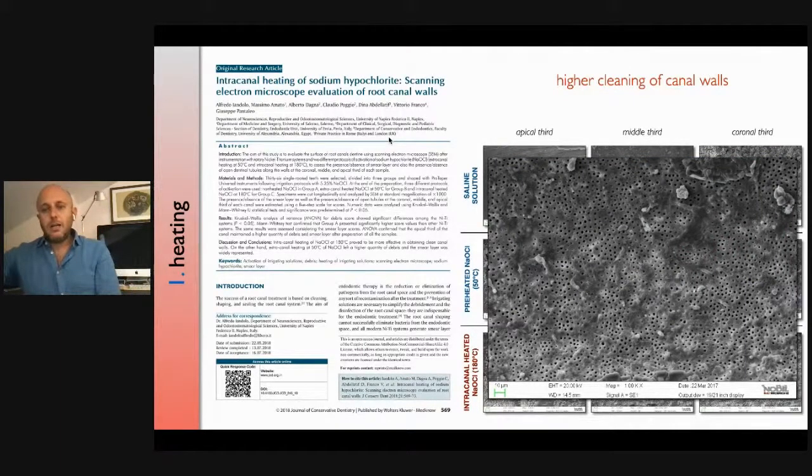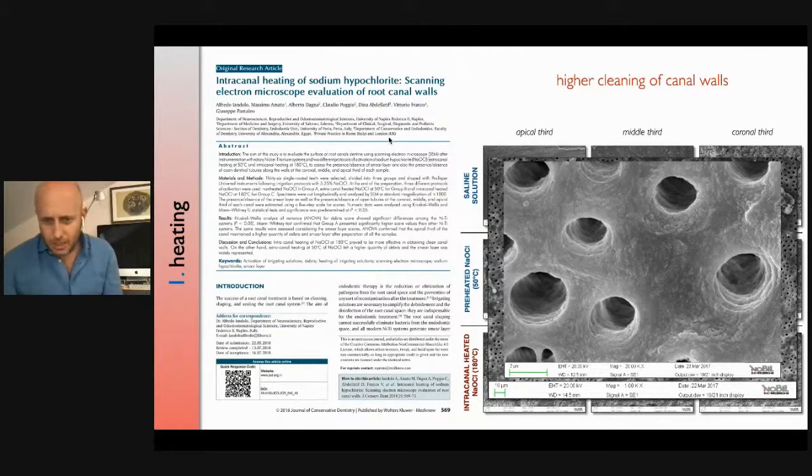These images we took at the University of Pavia are images of dentinal walls cleaned only with the use of sodium hypochlorite without the use of EDTA. And thanks to the activation, to the heating, and to the mechanical movement of the boiling solution, you can see a good removal, an interesting removal of debris, because you can see the open dentinal tubules. These images were taken at 20,000 magnification. You can see the dentinal tubules without any signs of thermal damage, totally cleaned, totally exposed, and perfectly visible along the dentinal walls.